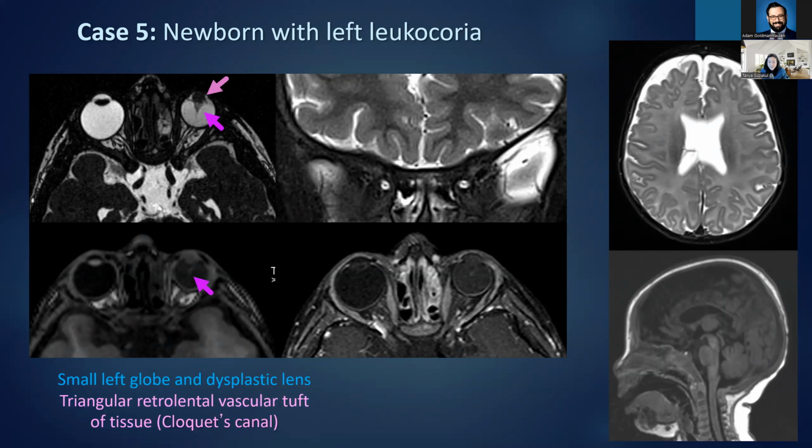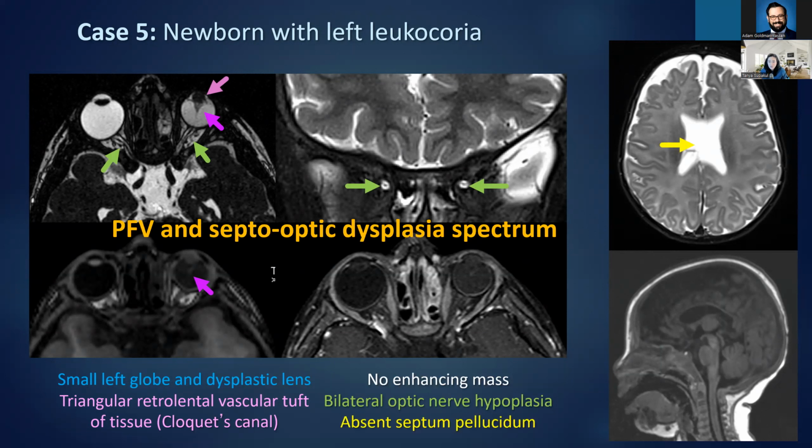But in summary, this patient has PHPV and also septo-optic dysplasia spectrum. And we are the ones who tell the clinician that, besides the PHPV, they also have septo-optic dysplasia, so that they can do some more workup.